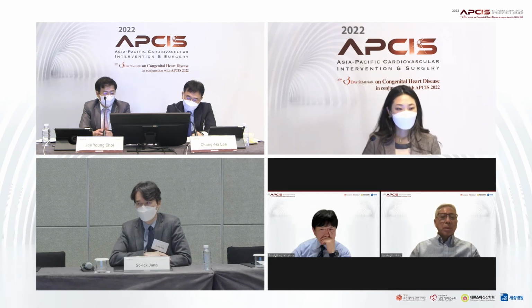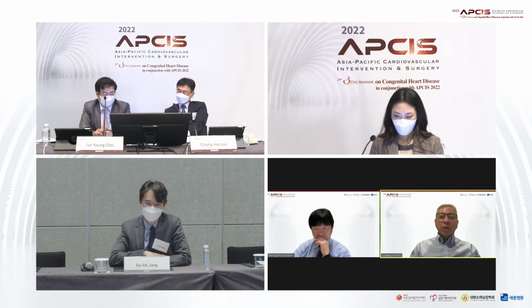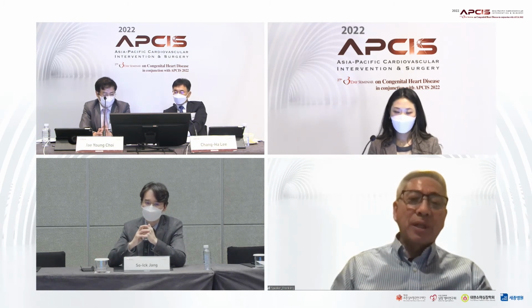You are the teacher of all of us. Well, this kid weighs 14 kilos at this time, right? And again, we have access to the Valeo stents. The Valeo stents that are mounted on 9s and 10s go through a 7 French sheath, and those can go up to even 20 millimeters if you need. Of course, when you get to that size, the radial strength is not that high. So I think a 14 kilo kid can handle two 7 French sheaths if you have the Valeo stents available.